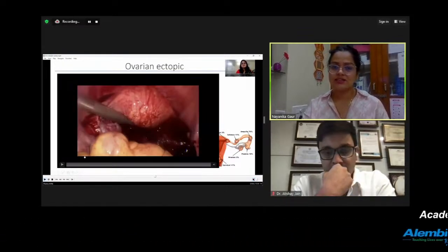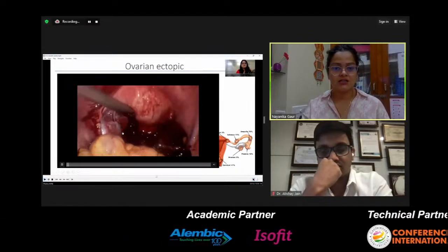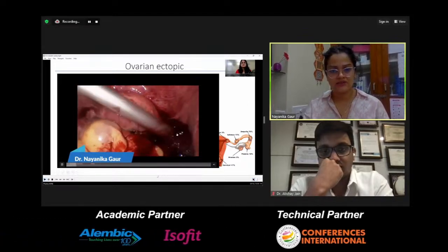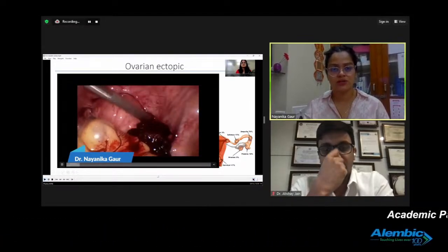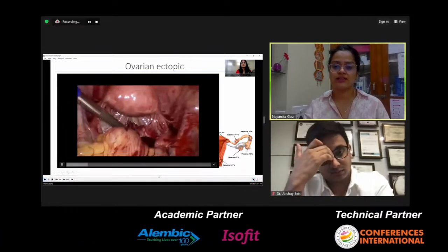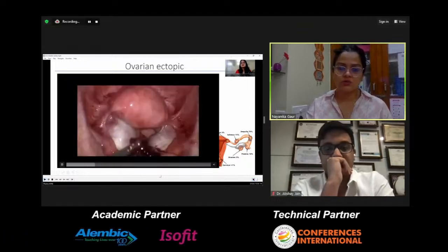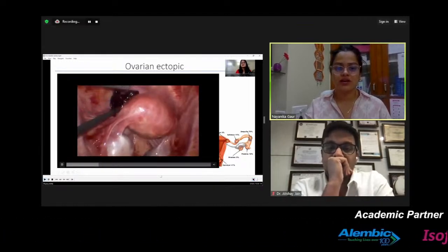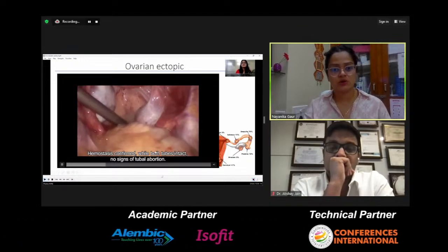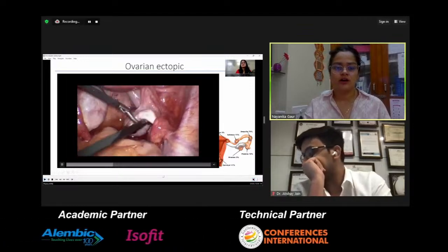Now, this was another interesting case of an ovarian ectopic pregnancy. Here, in this patient, there were a lot of blood clots in the cavity, and as we removed the blood clots, we were trying to find the pathology because the tube on the right and the left side was looking grossly normal. There was a large blood clot which was actually covering the right ovary, but as we removed the clot, we found the rest of the entire pelvis to be absolutely normal. There was no other site of bleeding or a pregnancy.